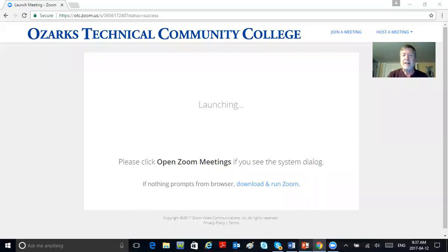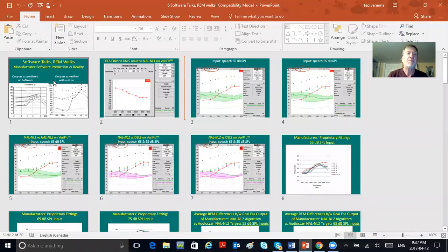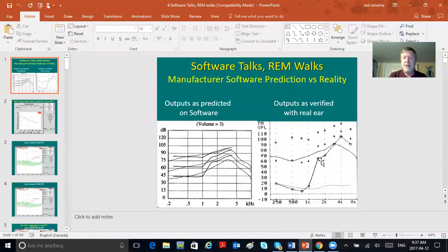We also last week ended with putting together real ear along with fitting methods. So let's take last week's PowerPoint. I'm going to show you some pictures from last week's PowerPoint, and then we can launch into what we're talking about today, all right? I'm going to share screen here, and I'm going to try and get that PowerPoint. Here we go. When you take a look at this screen, you will see what today's talk is. Software talks, real ear measurement walks, manufacturer software prediction versus reality.